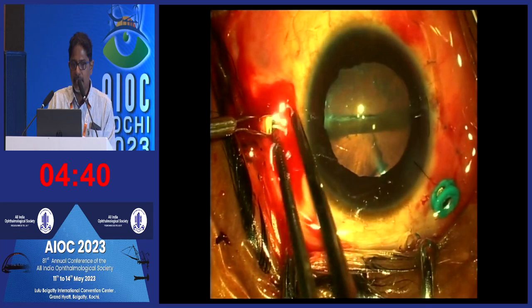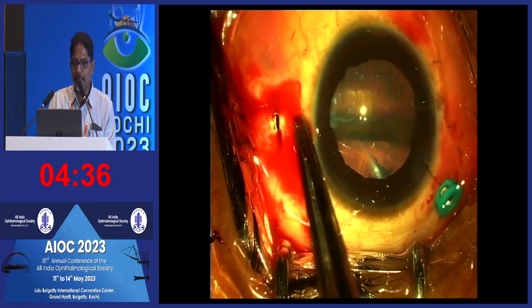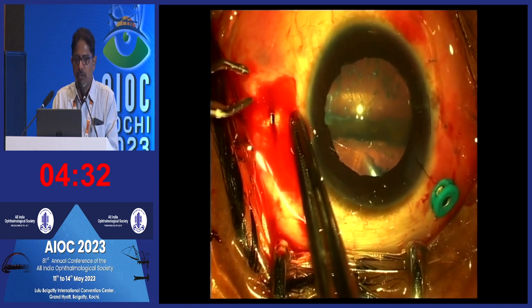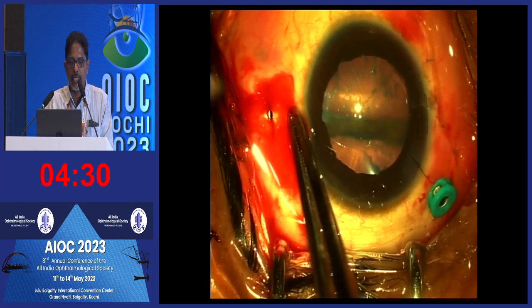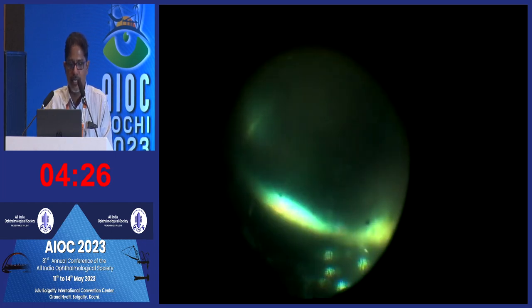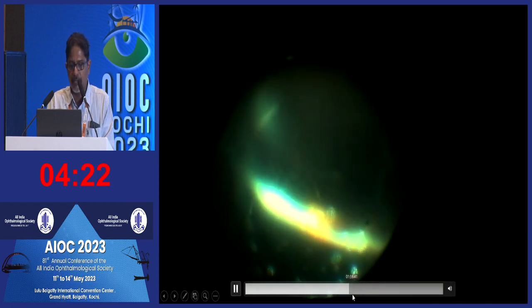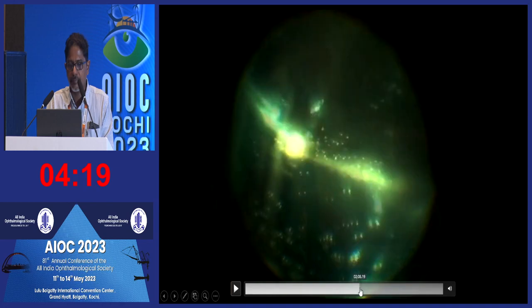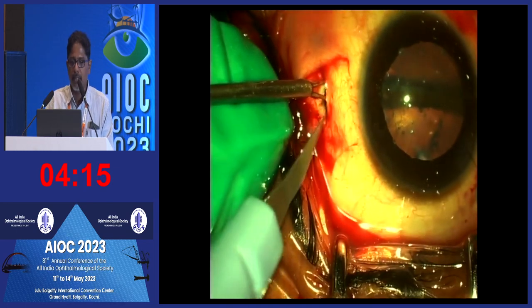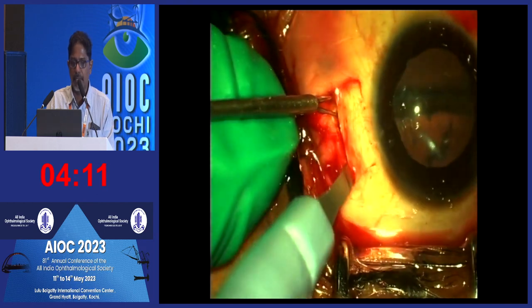I'm holding the stick and trying to remove it, but you can see that it slips off. Even so, the foreign body is not falling down, because of the high viscosity of the silicon oil inside. So here I'm using silicon oil as an adjunct to prevent retinal injury in case the foreign body falls, especially with a non-magnetic foreign body. I'm going inside again to grasp the foreign body with the same forceps, and now the foreign body is coming out. I'm extending the sclerotomy a little bit to prevent the foreign body from falling again.